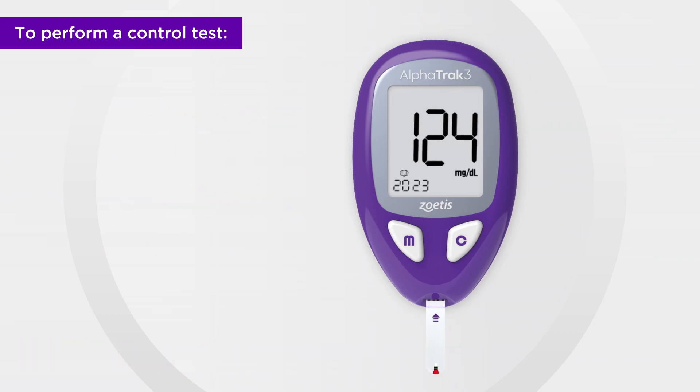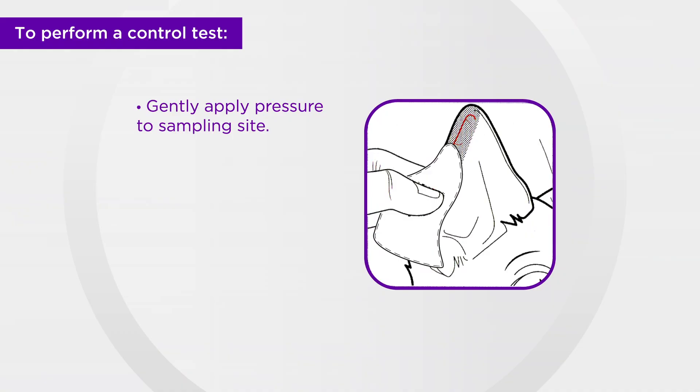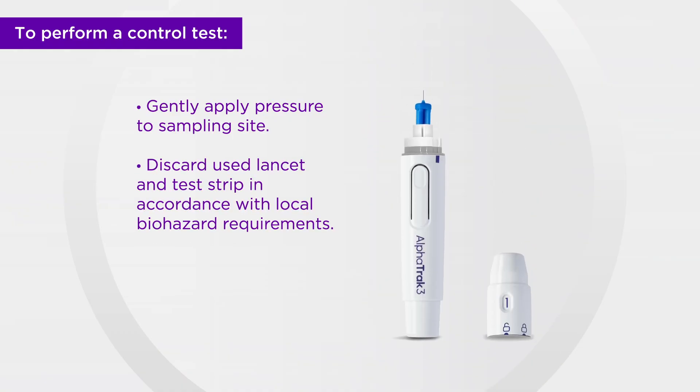Gently apply pressure to the test site to stop any bleeding. Finally, discard the used lancet and test strip in accordance with local biohazard requirements.